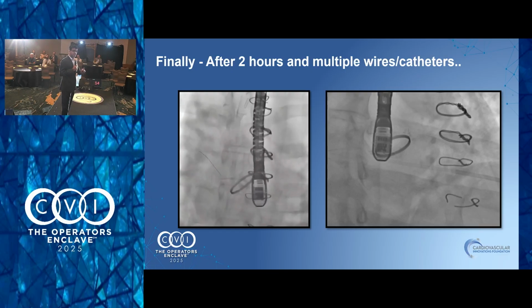I think it just flopped. It was such a small hole that it just found its way a little bit. Because after that, the 035s, the stiffness gets in the way. It does, and it's just flopping around. I had even tried a coronary wire. We tried a run through, the V18s. We tried a bunch of things, and as I said, sometimes you just have to be lucky. I was like, okay, 10 more minutes at 7:15 p.m. The surgeon may have to take this patient later on.